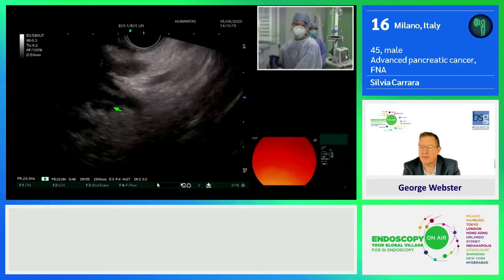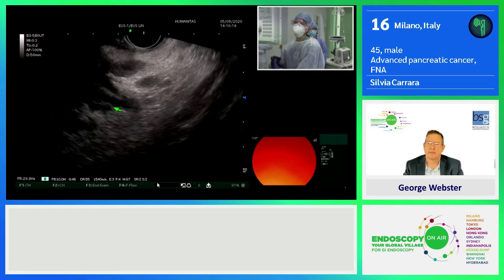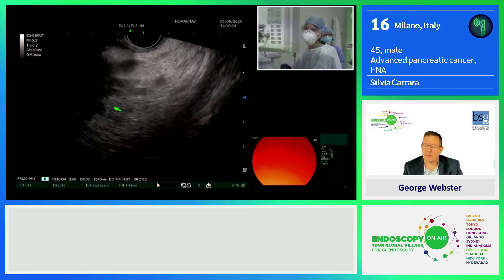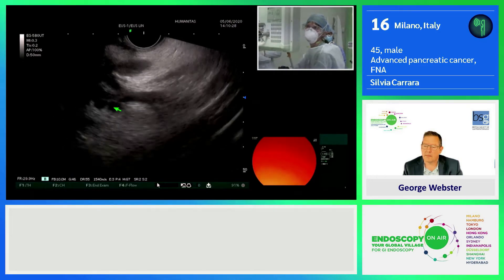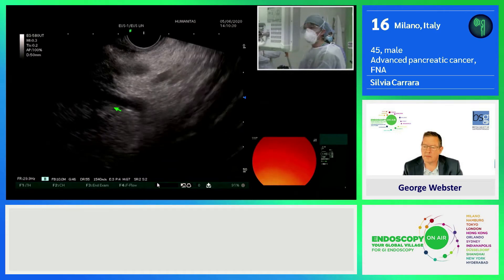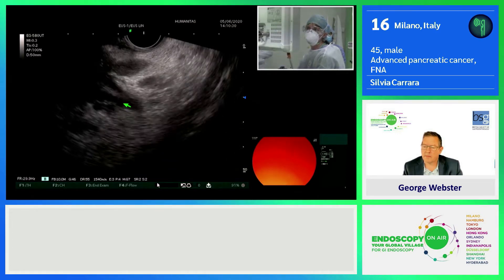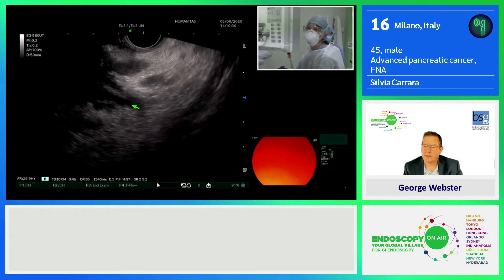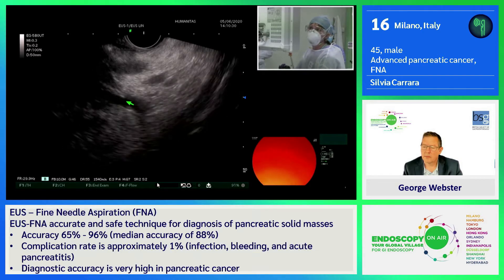Pancreatic cancer. The patient had pain in February and underwent EUS and a CT scan that demonstrated a very deep mass in the uncinate process. The tumor is very deep and is also infiltrating the jejunal vessel going to the mesenteric vessel, which means it is a T4 pancreatic cancer.